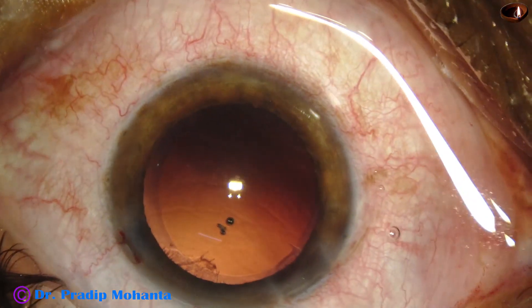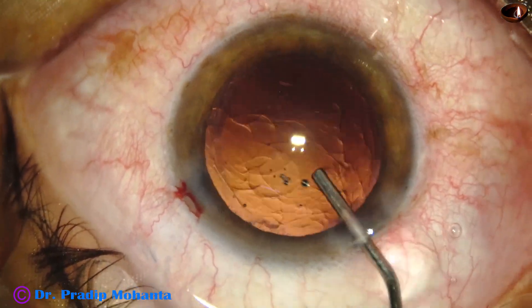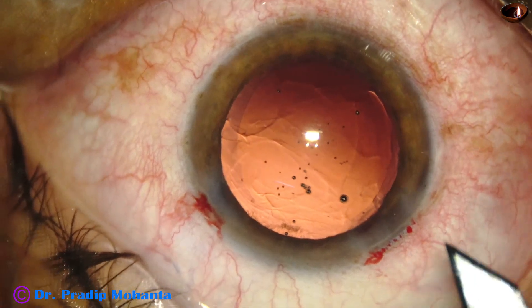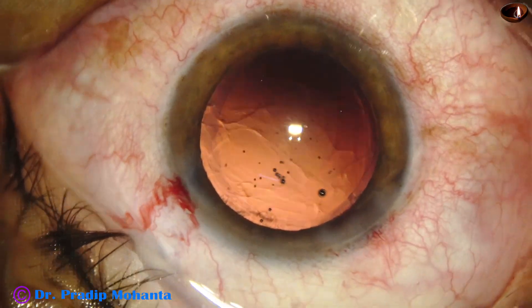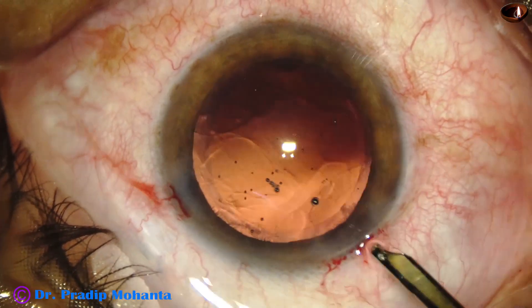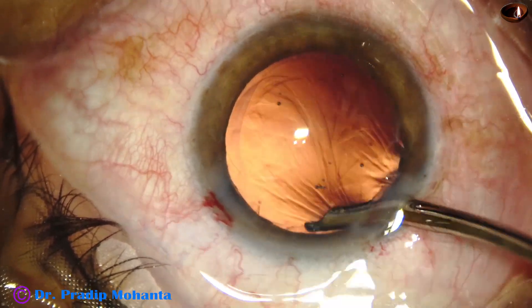Hardly any cortex in this case. The anterior chamber is filled up with visco. I am going to use a foldable IOL. Enlarging the main wound a bit, and a single-piece monofocal aspheric intraocular lens has been selected.